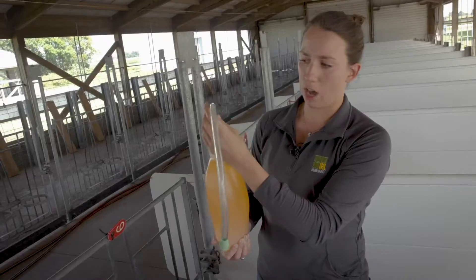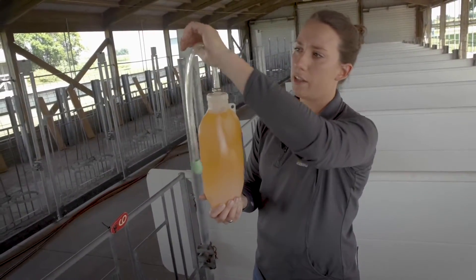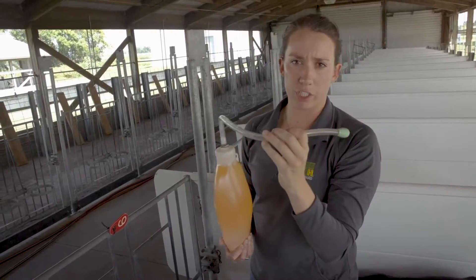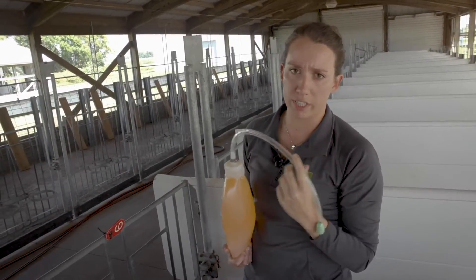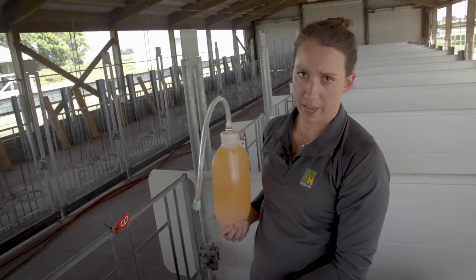In those cases, we have to use what's called an esophageal tube feeder. The solution is held in a container below, and there's a tube which will go into the esophagus of a dairy calf. It's very important when feeding with an esophageal tube that the liquid does not go into the trachea and then into the lungs of the animal — that is truly the most important consideration to keep the animal safe and get it back to being a healthy calf.